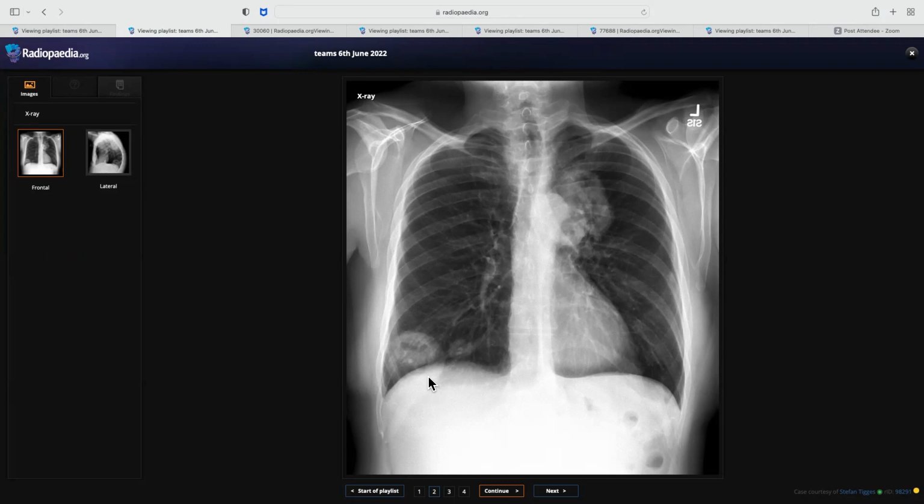So once you come to the conclusion of multiple cavitary lung lesions, when you're asked about the causes of cavitary lung lesions, it's good if you are more systematic, like infections, then malignancy. In malignancy, you can tell primary and metastatic, and then you can come to autoimmune, then vascular, like that. It looks good if you categorize; those are the basic categories which you can apply everywhere.